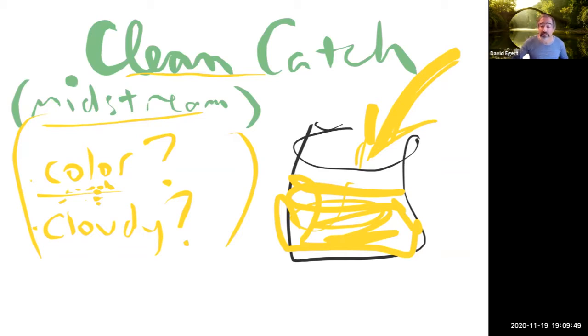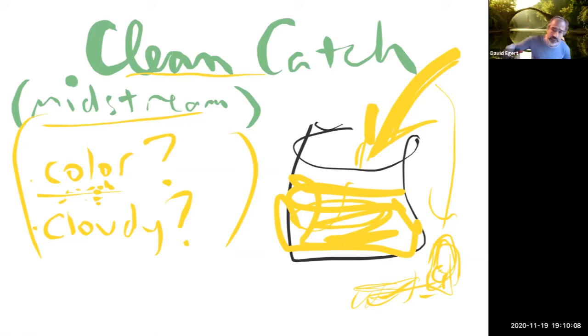In the old days, you had these complicated procedures, like you'd have to take a bit of urine, mix it with a particular little crushed up pill and look for a reaction. It was a big to-do just to look for glucose or just for ketones. For pH, you used your little pH paper, and everything was its own test.